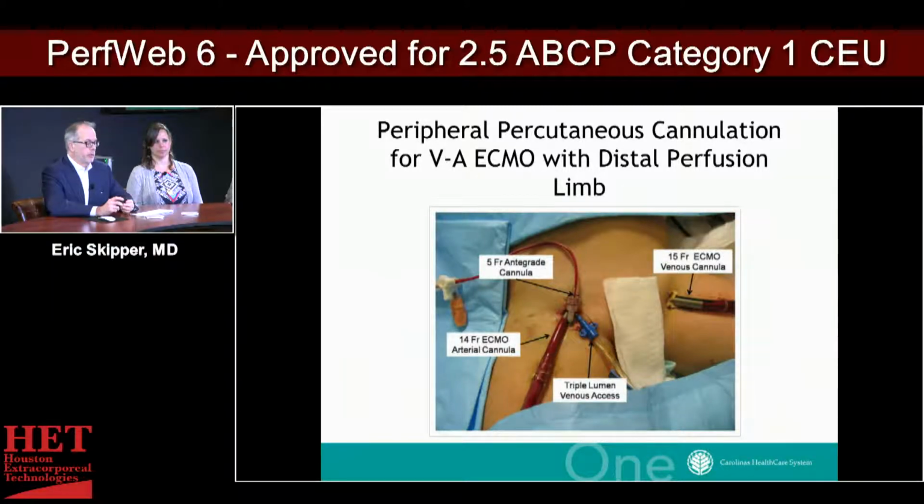It also shows that in the small patient, they've chosen to place the venous cannula on the left, thus not impeding both arterial inflow to the leg and venous outflow from the leg. And I think when you have smaller patients, especially younger patients with very vasoactive arteries, this cannulation strategy makes a lot of sense.